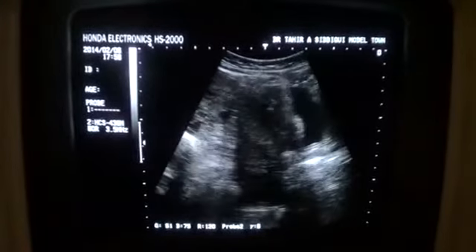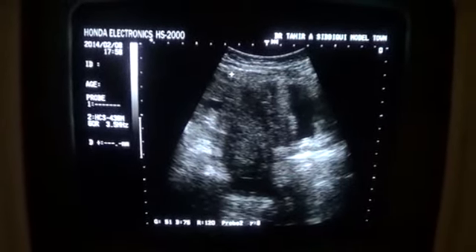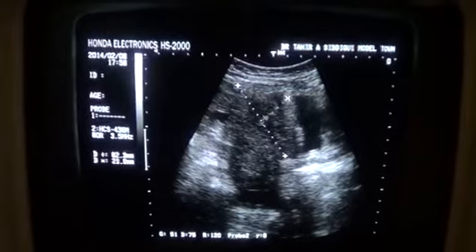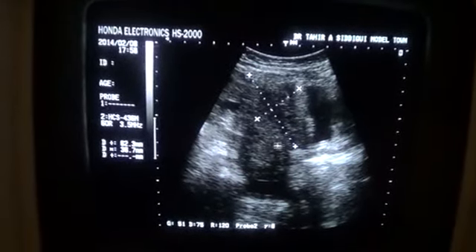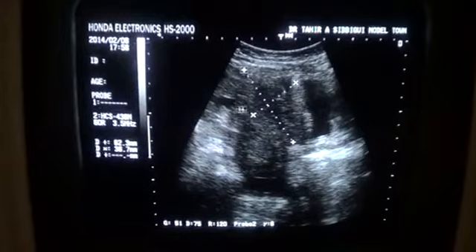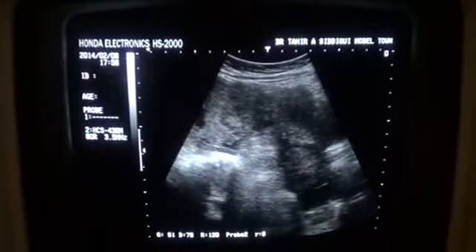This being the uterus in longitudinal section. This area is the uterus. This posterior wall is not well demarcated or defined. This is the urinary bladder, with all this echogenic area is bleed, possibly bleed by ultrasound parameters, as I can see it.